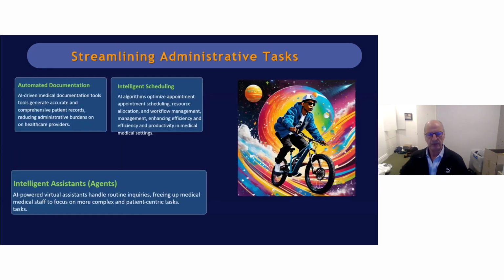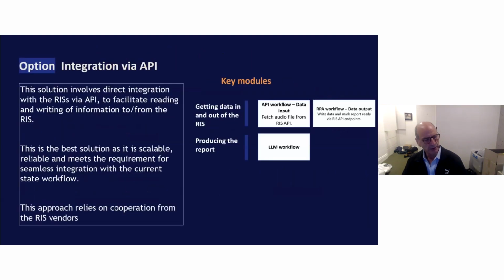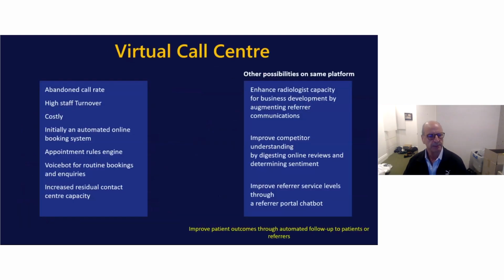We use it and are developing algorithms to automate documentation and for intelligent scheduling. As we know in radiology practices, a lot of the scheduling is based on the practice, who's there, the modality, and can act as intelligent assistants. I might skip this other to say that we're well down the line in I-MED of developing a virtual typist, and I think some of those things Sajith might cover in his presentation. Basically, these typists will type reports in an intelligent way in the style of the person reporting.